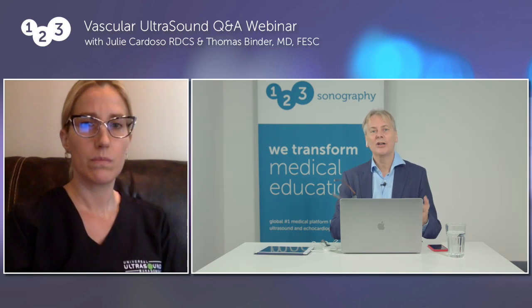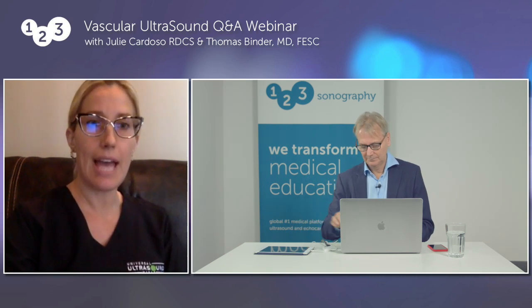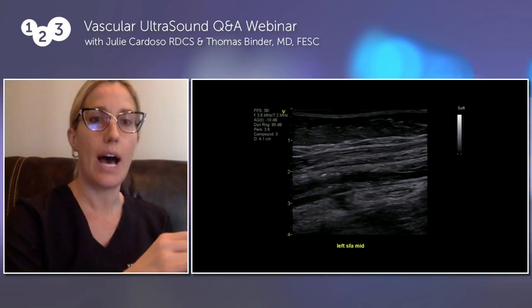We got a question from Akbar, and he wants to know, which terminology would you use to describe a plaque? Well, it depends upon the characteristic that it displays on B mode. So right now, the criteria for plaque characteristics is for B mode and basically has to do with the echogenicity of the plaque that we see, and also the characteristics, whether it's irregular, if it's ulcerated, or if it's smooth. So it's smooth along the lumen of the wall.